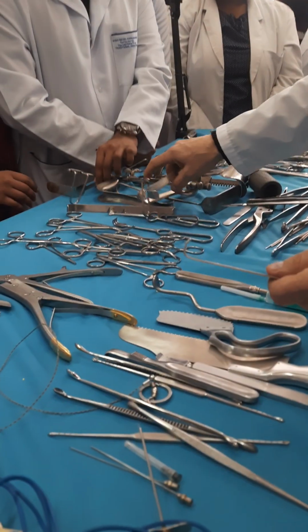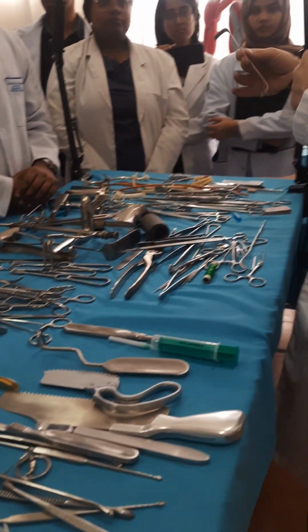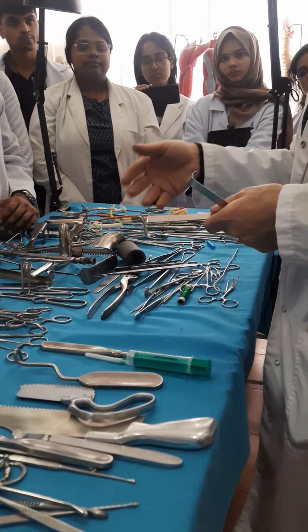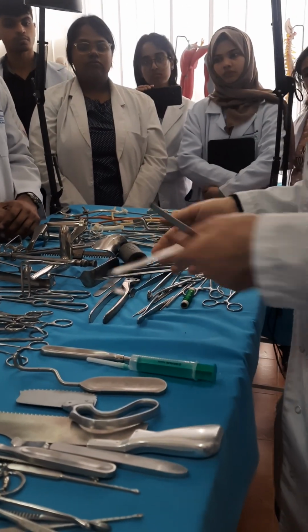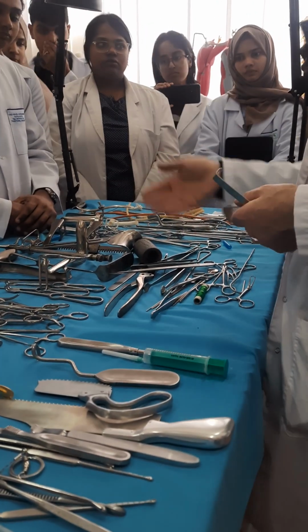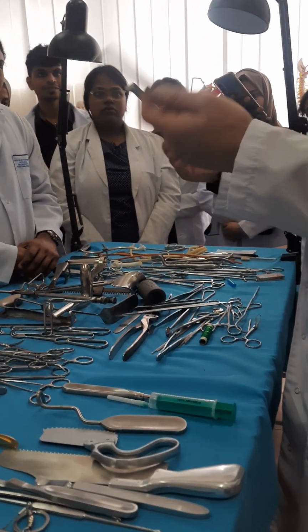Let's continue. Now group number 3, as you remember, we call it general. Why such a kind of name? Because they don't have specificity. Any kind of surgery in any region of the human body can use these instruments. And the first big subgroup inside of group number 3 is hooks. Otherwise we call them retractors.